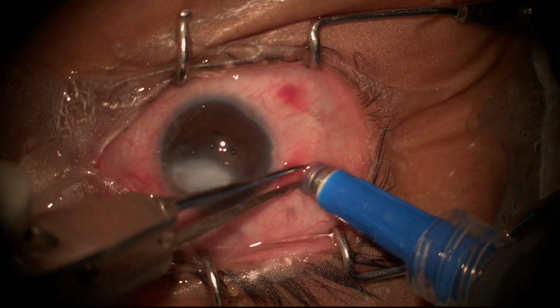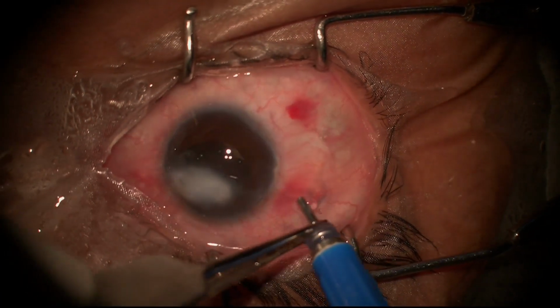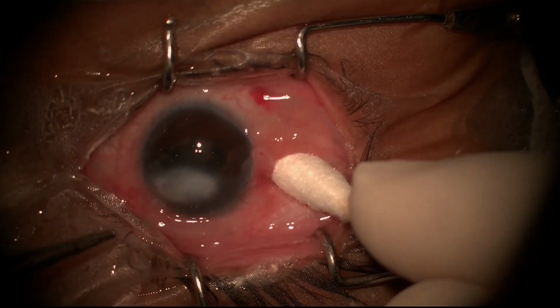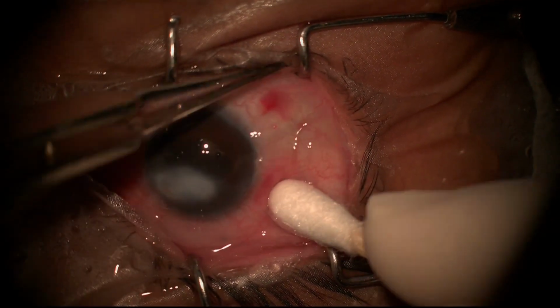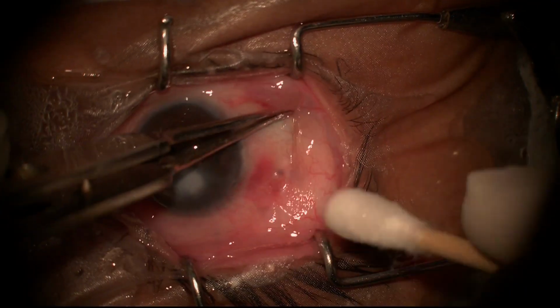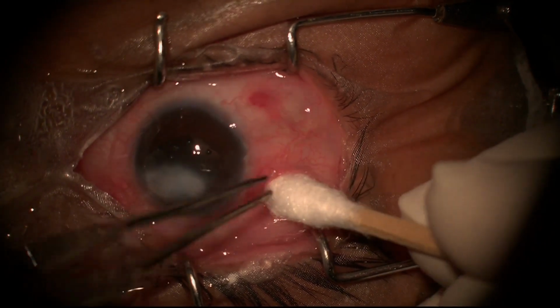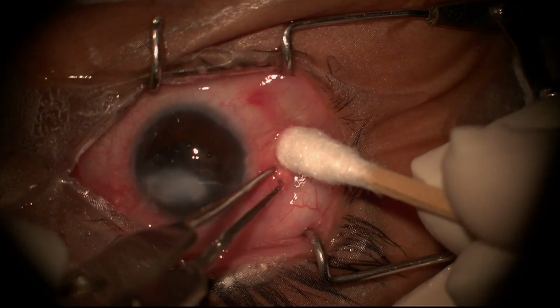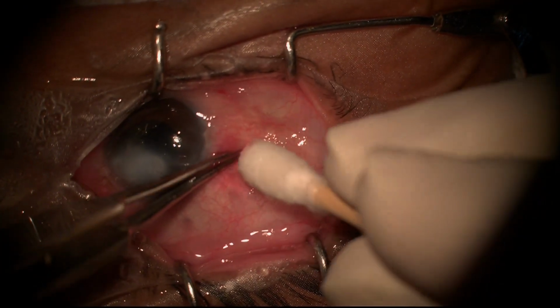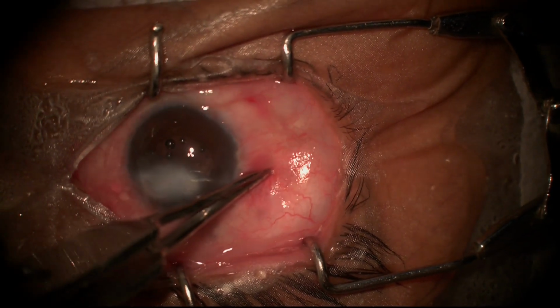We will need a soft stick. Put in one suture. See, the globe looks so healthy now. Yes, sir.